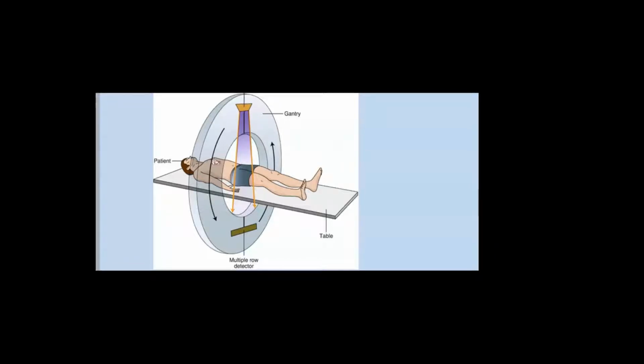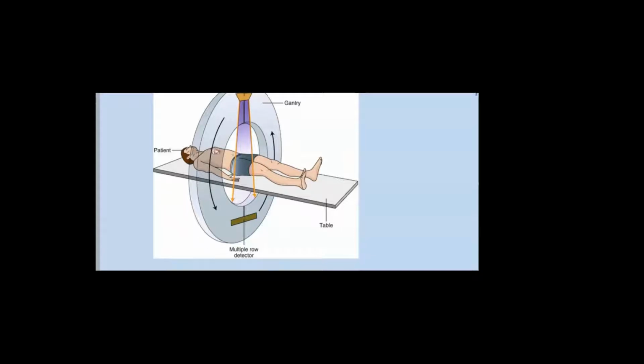So we can slow down the object, and we do that through the heart rate. Exactly. That's why beta blocker is so essential in the CT lab. Give beta blocker one hour prior to the scan. The desired heart rate is 65 and lower. That's a way of improving the temporal resolution, by decreasing the heart rate. Beta blocker is essential in cardiac CT.